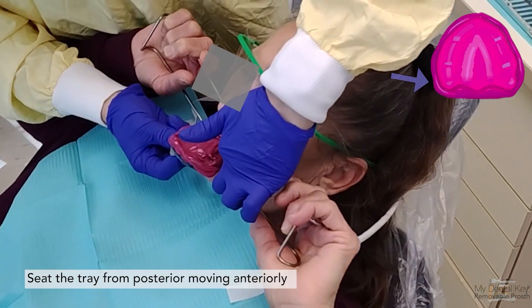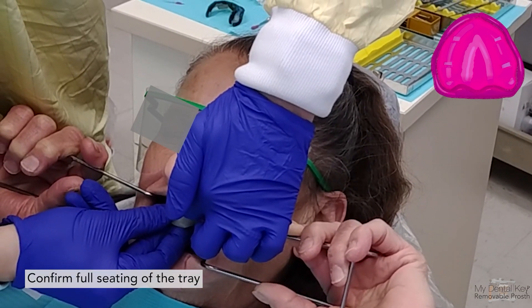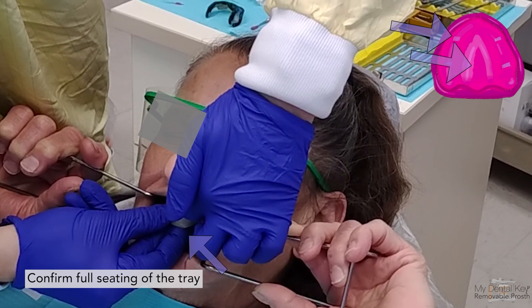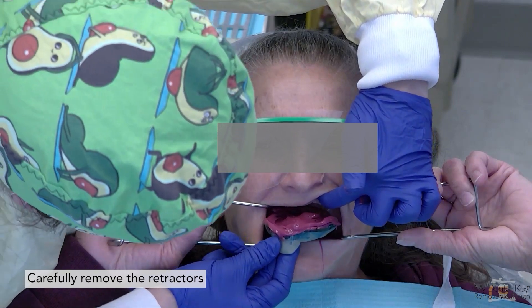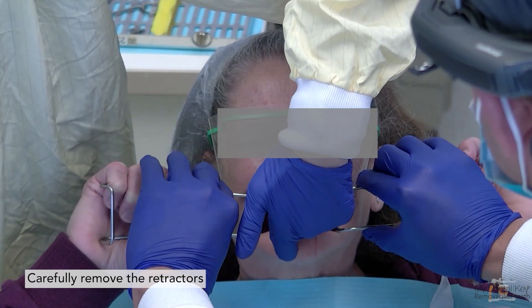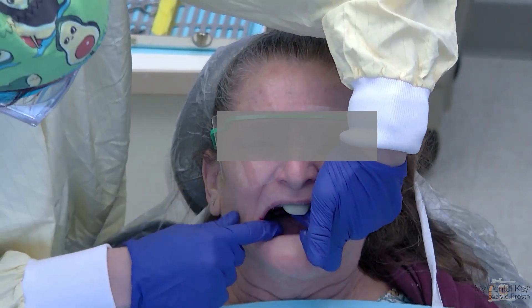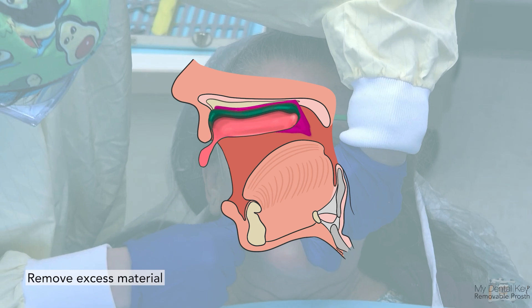Seat the tray moving from the posterior to the anterior as you place it. Confirm full seating and support with bimanual pressure, holding around the canines or the palate to stabilize the tray. If tissue rests are present, you should feel them seat and sense that you can go no further vertically. Once fully seated, tip the patient upright for comfort and carefully remove the retractors. Use your fingers or cotton swabs to remove excess material expressed from the posterior to prevent gagging during setting.